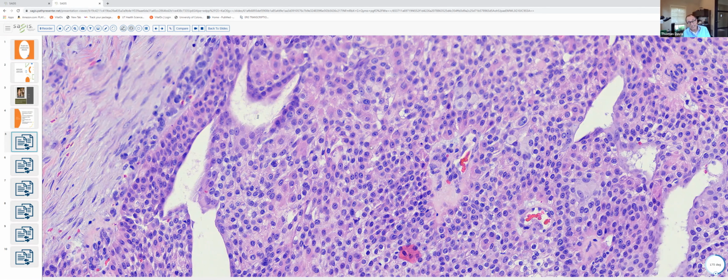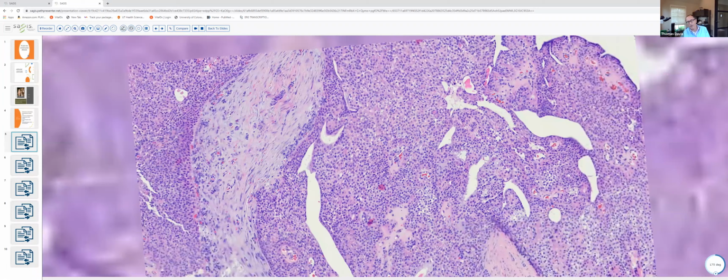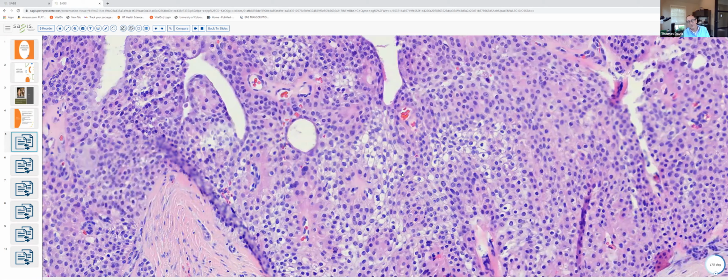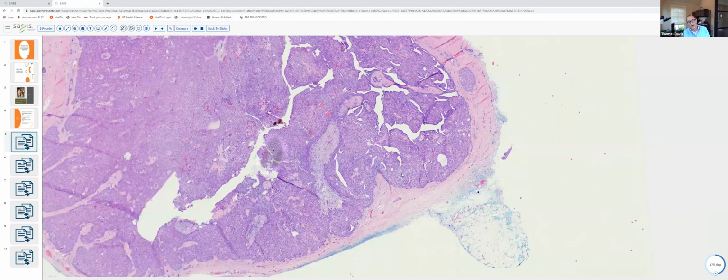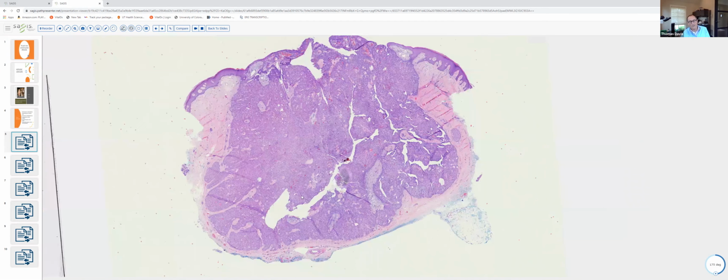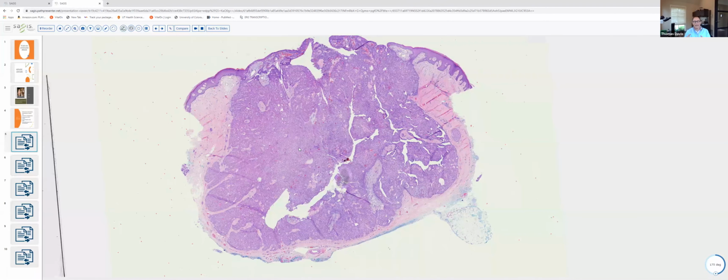Occasionally, one can see a nodular hydradenoma composed almost entirely of very clear staining epithelial cells. And you'll sometimes see that tumor referred to as a clear cell hydradenoma, okay? Sometimes within a hydradenoma, rather than having a solid nodule of cells like we have here, one will see areas of large cystic degeneration. And in that case, the hydradenoma may be referred to as a solid cystic hydradenoma.